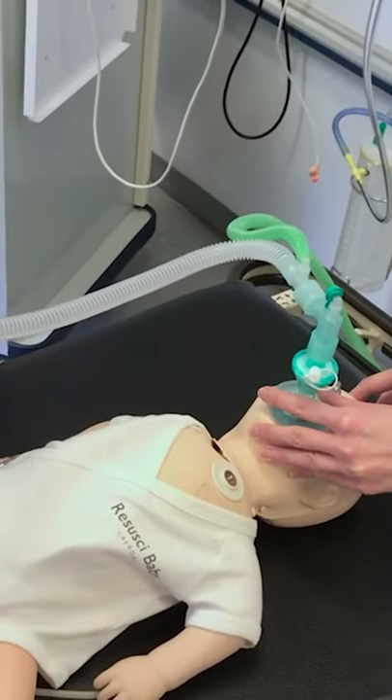Turn your wall oxygen to 15 litres per minute and adjust your PEEP. It's as simple as that.